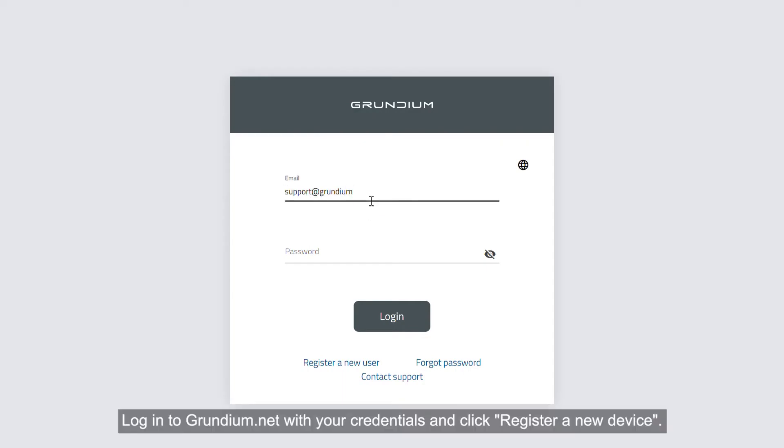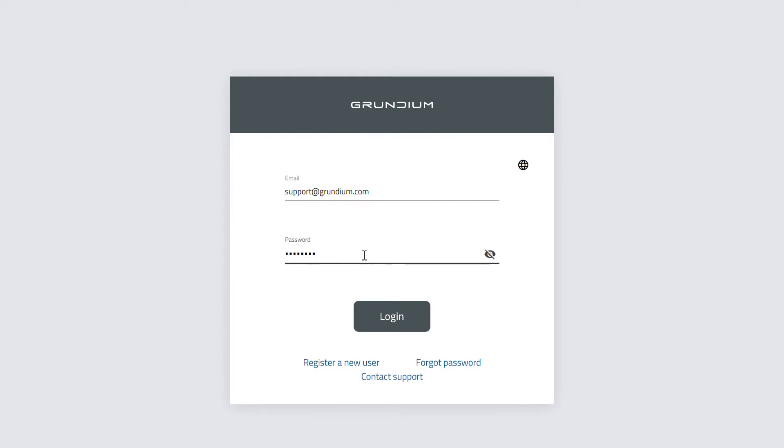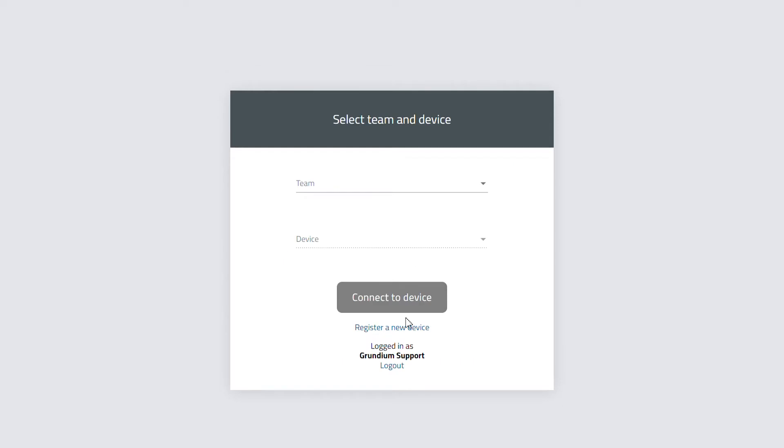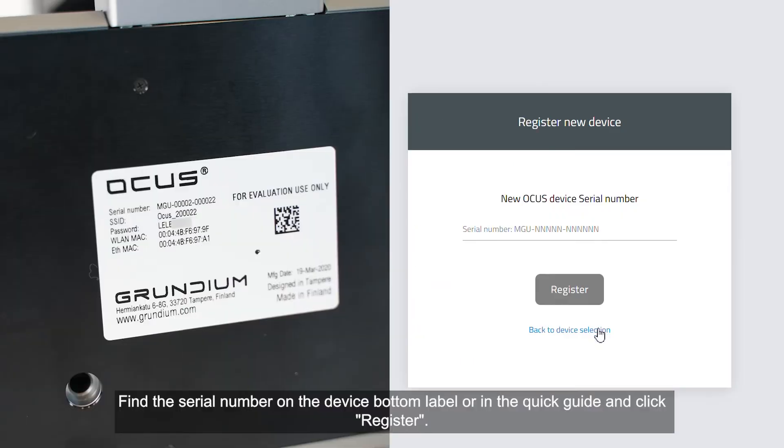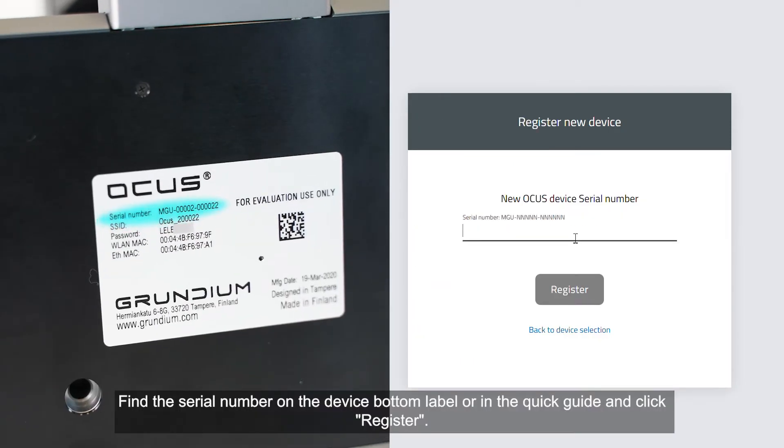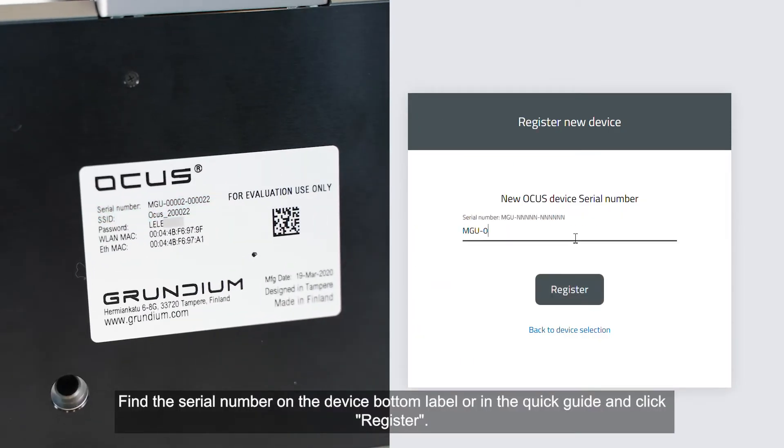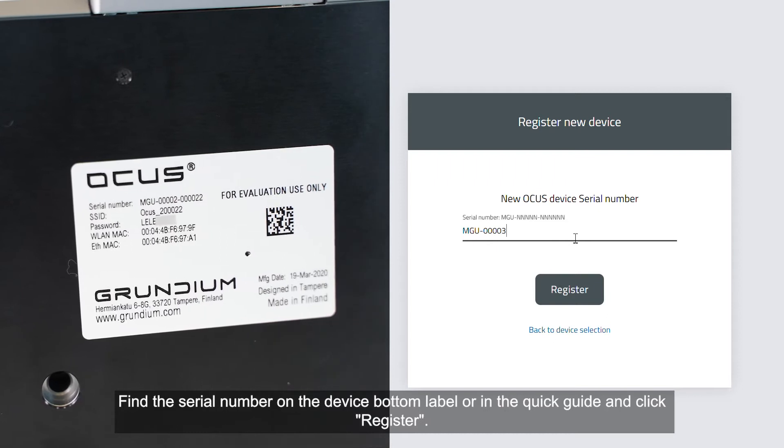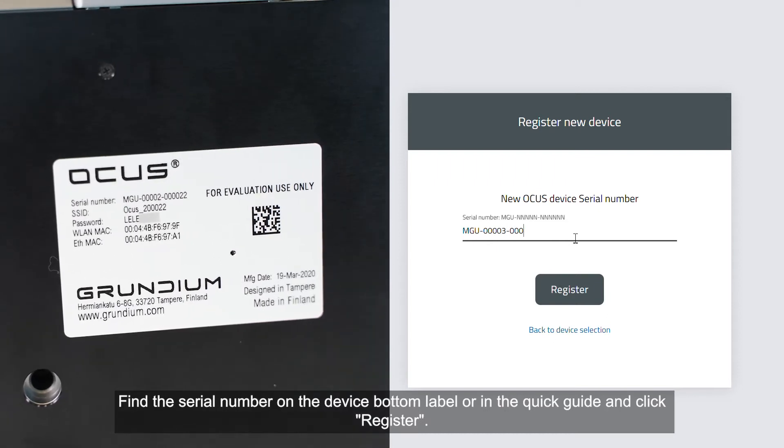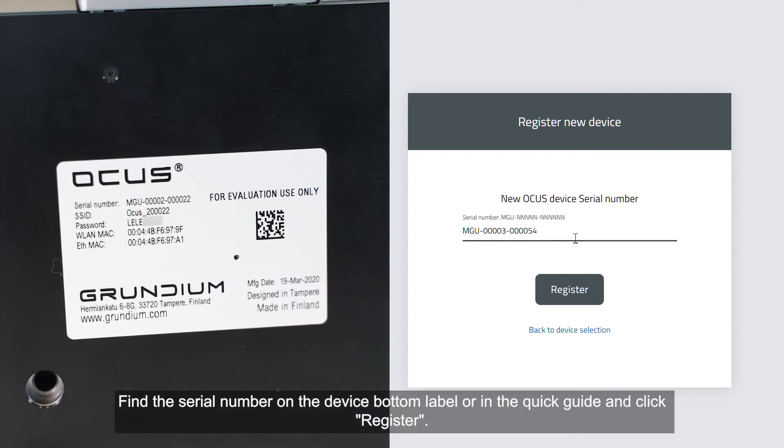Login to Grundium.net with your credentials and click Register New Device. Find the serial number on the device bottom label or in the Quick Guide and click Register.